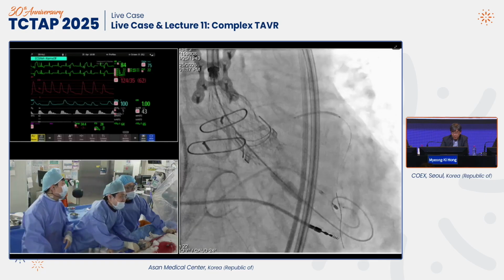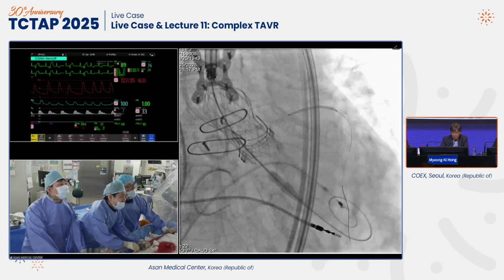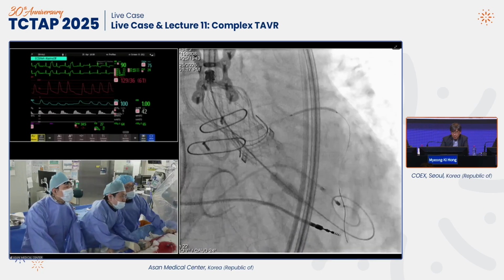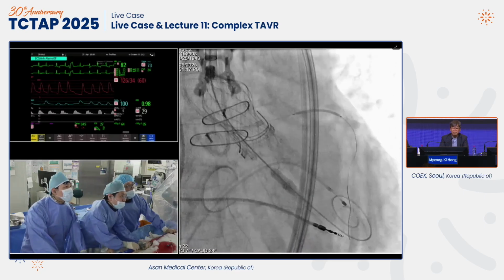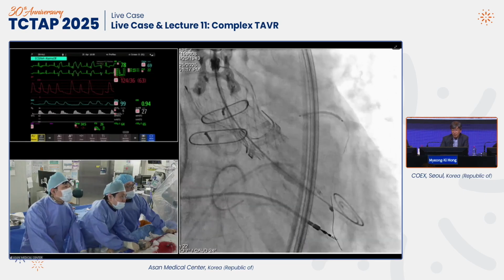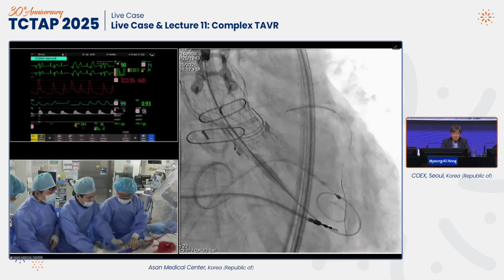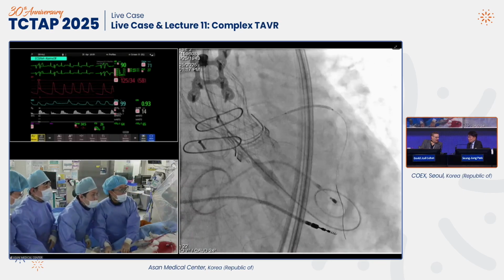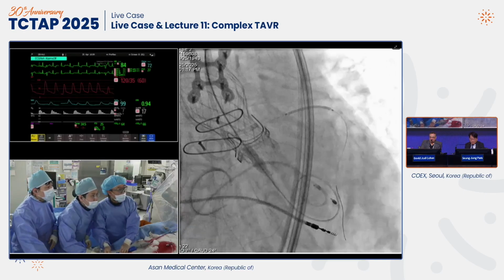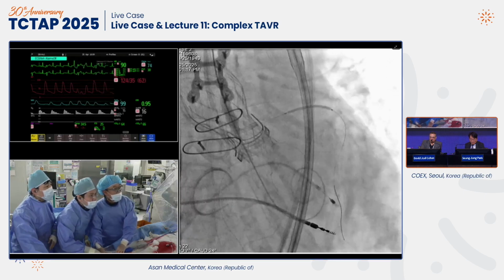Release. Yeah, Junghoon is frozen by the comment. Okay, great. Release. It's almost there. Okay, good. Release. Tension release. Now release more. Okay, release. Okay, not yet. Release, not yet. One is still on. There you go. Okay, got it. At this moment it's very important. And then remove the wire. It's the nose cone. We are very careful. Okay, got it.